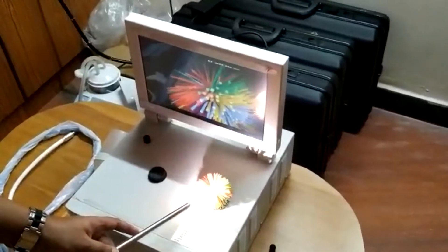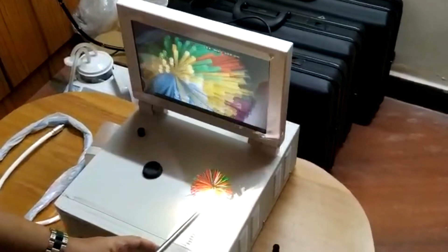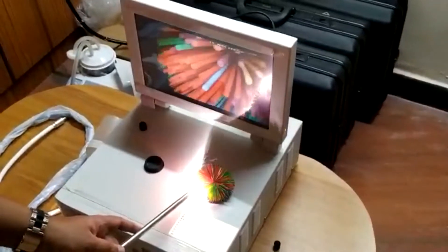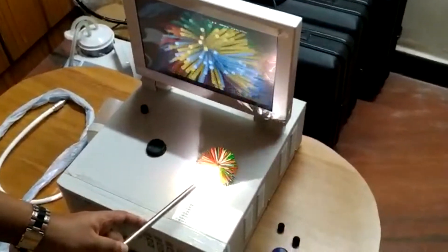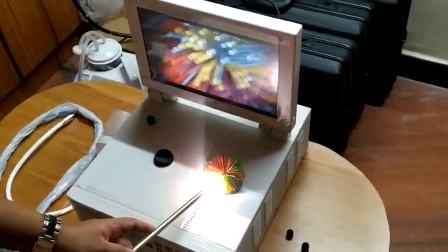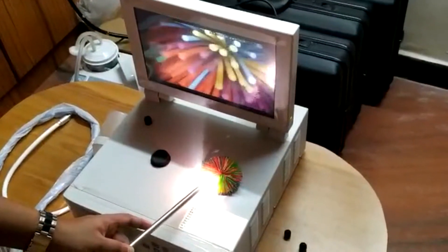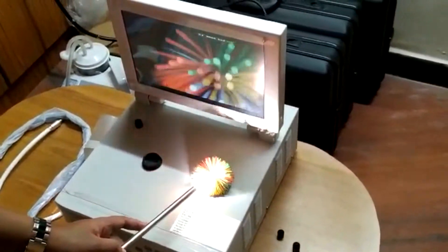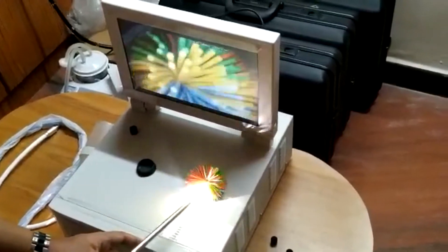Adjust the focus and now you can see the clarity. Whichever existing rigid scopes you have — of periurban base — or whichever flexible or rigid fiber optic scopes you have, you can use them with our camera head and light guide so that everything can be converted to a video scope.